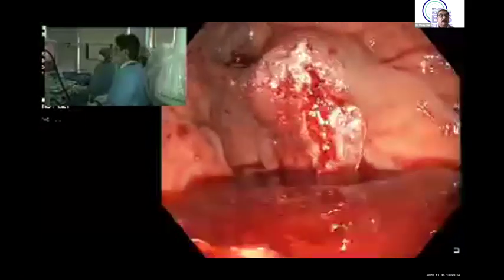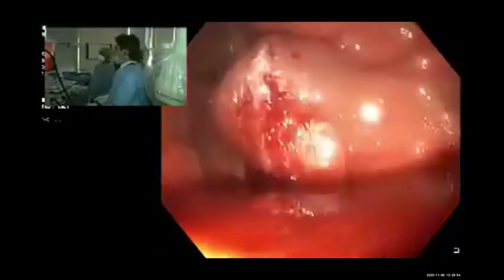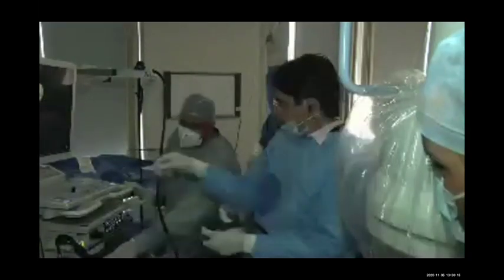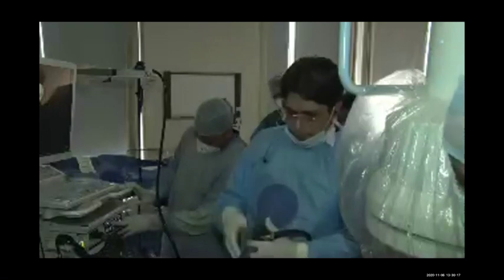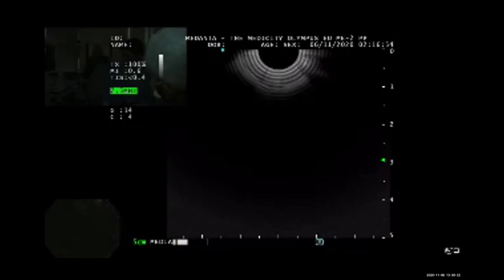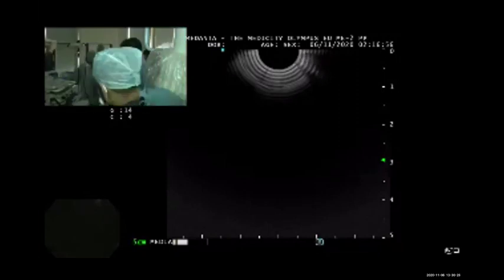Are you going to show anything else or should we move on to the next lecture? No, we can show another case, or we can put in the EUS and demonstrate the status of this varix. Okay, quickly do that. Then we'll go. Can you put the EUS scope now? Please put the EUS scope. Is it on? Remove the needle. I need water also. Is everything on now, EUS? Okay, please apply the suction. Ashwini, can you put the suction better?